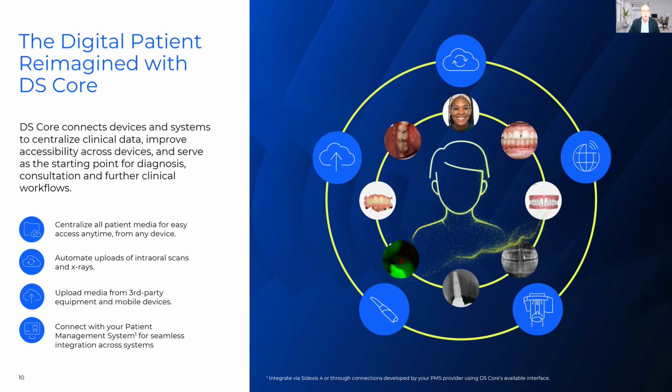So if you think about where you're currently at in your practice, you have multiple logins, you have multiple softwares, multiple versions of softwares, and how do we bring that together to bring that to the better patient experience? And this is where DS Core is centralizing all the technology, all the data together into one space, that way it's easier for the patients to understand the treatment as well as it's easier to present that treatment.